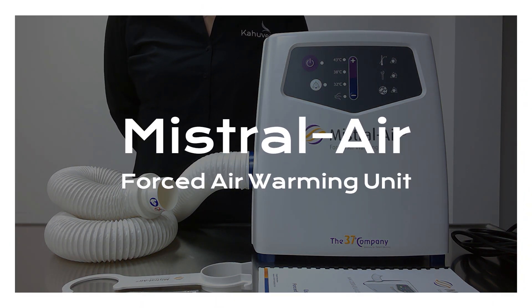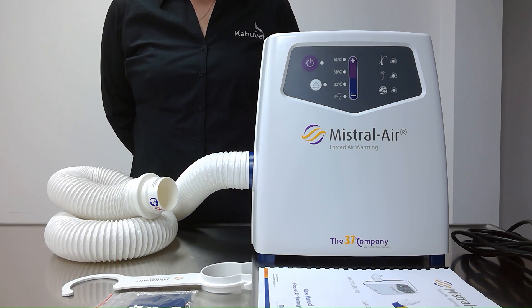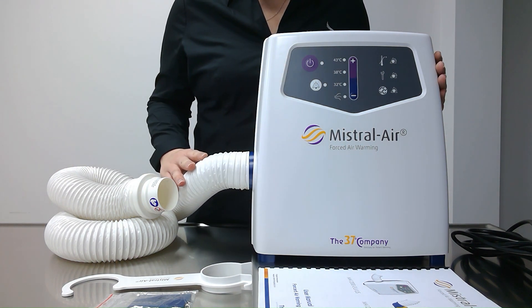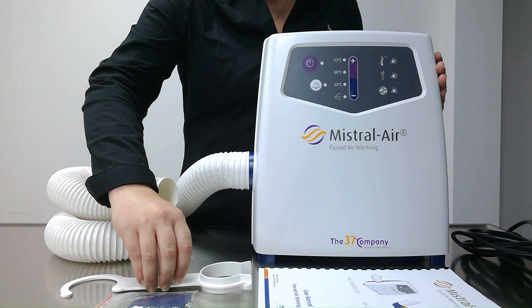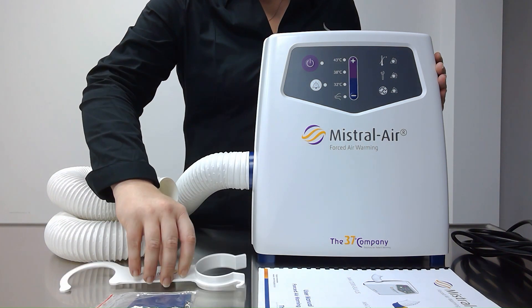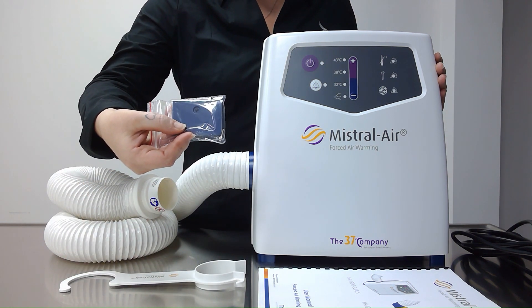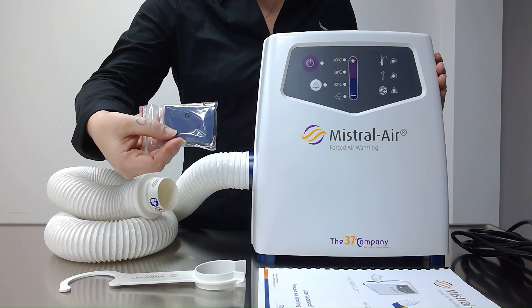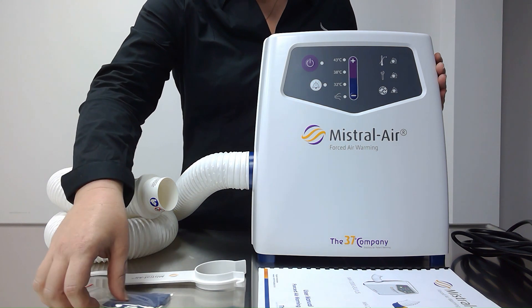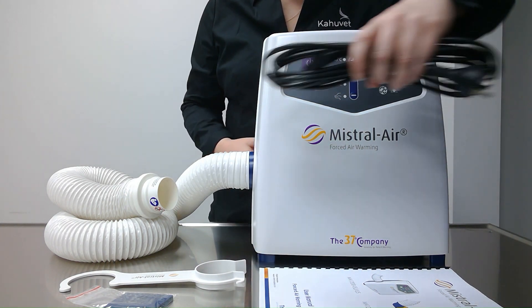This is a demonstration for your Mistral-Air forced air warming unit. Your new unit should have arrived with the following components: the unit itself with the hose connected, a connection hook that we can use to secure our hose, a plate cover and a four millimeter hex screw — required for the first setup of your Mistral-Air to secure our power cord and keep it safe — a user manual, and the power cord.